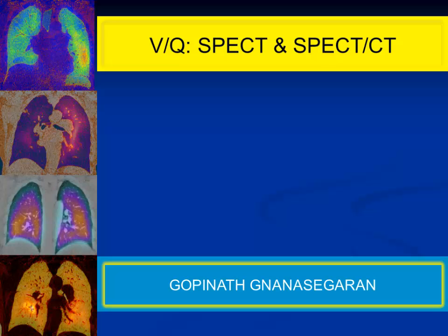The next topic is about VQ scans, which we do quite frequently in all the departments. Currently there are EANM recommendations that we should move from planar imaging to SPECT imaging. The only reason is they want to have a holistic approach.